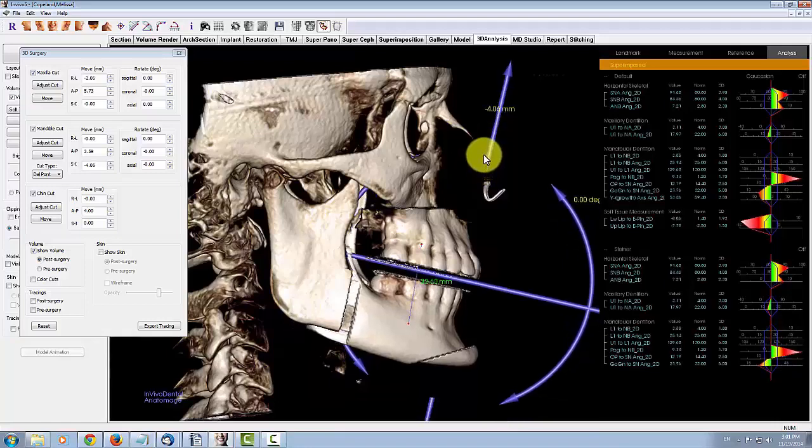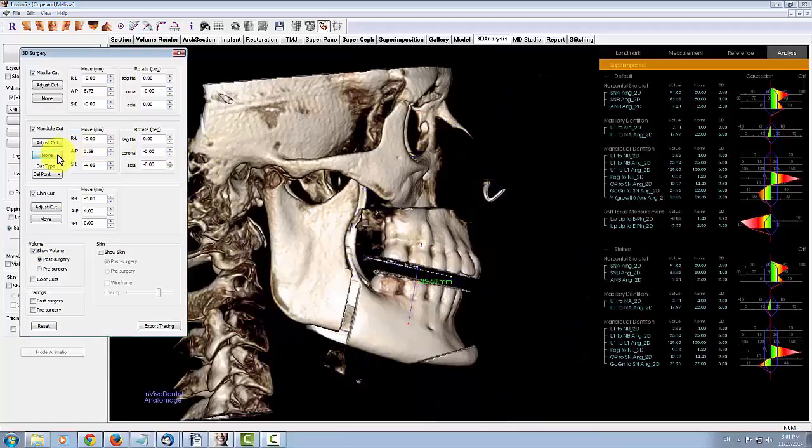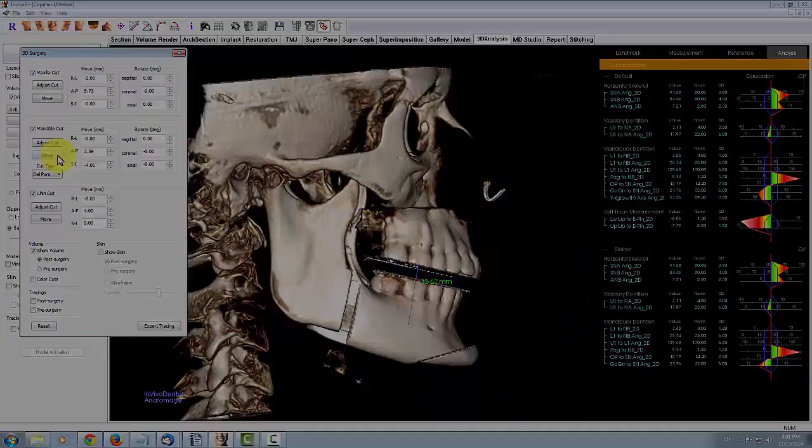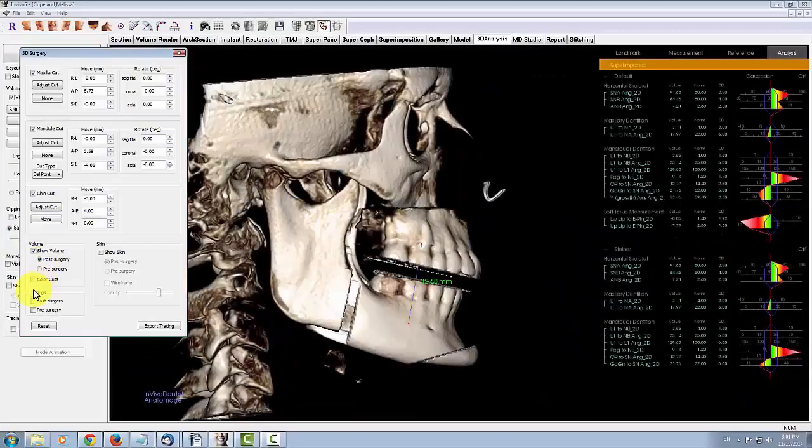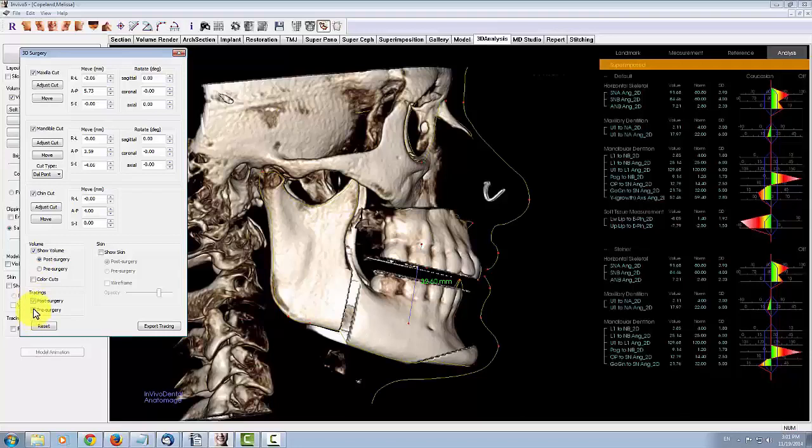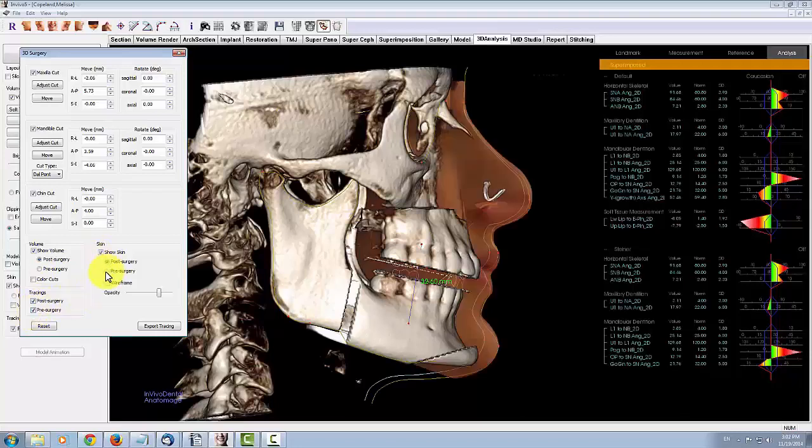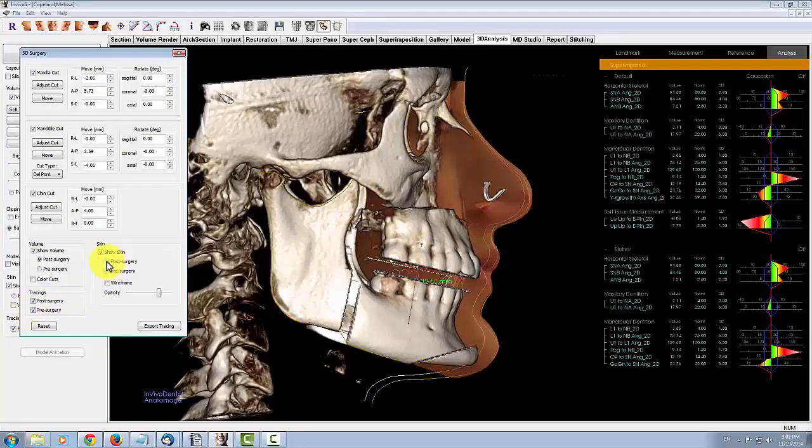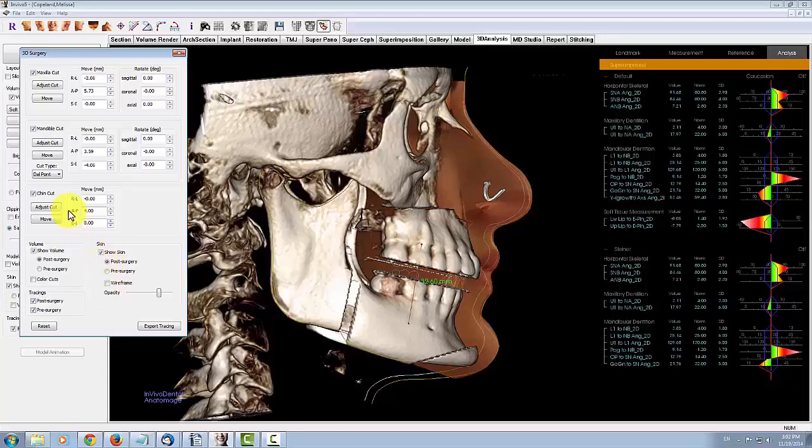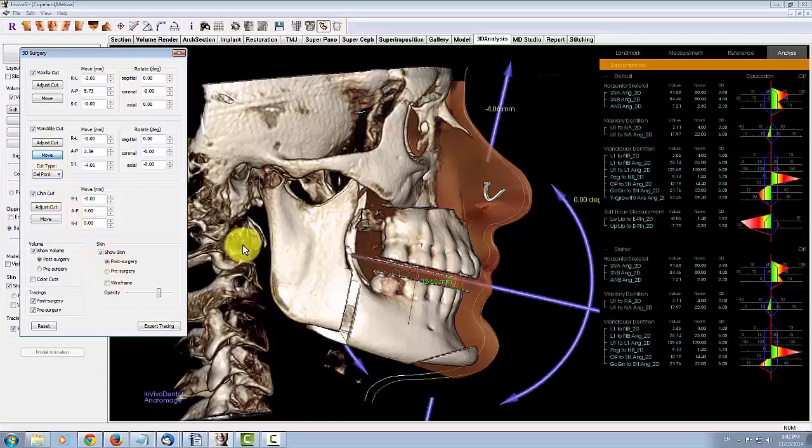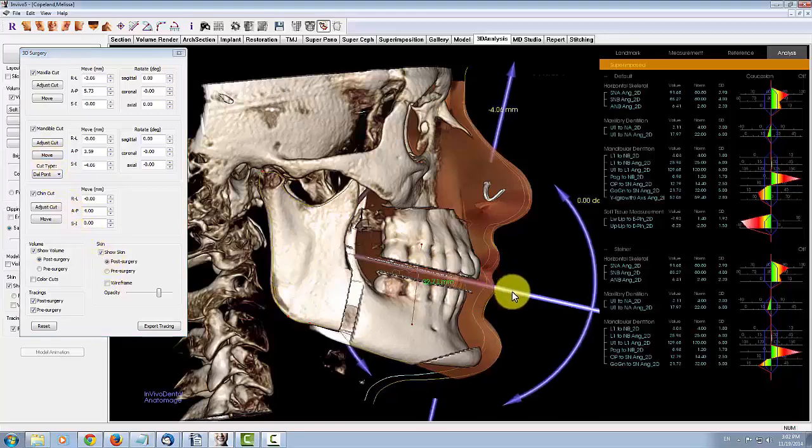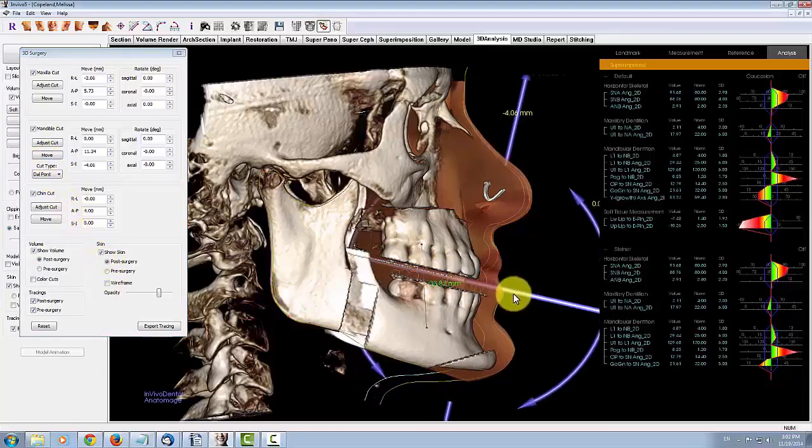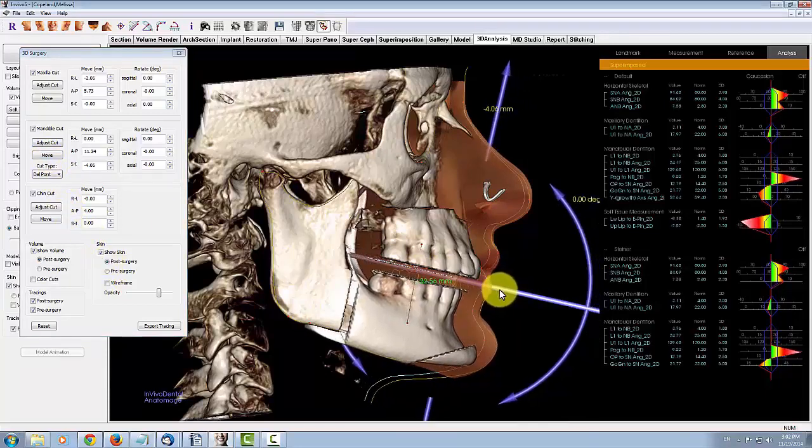If you have a skin overlaid with the scan, you can visualize the soft tissue deformation as you move the cuts by toggling on the skin visibility. Here we have the pre- and post-surgery soft tissue predictions. As we move the volume to simulate surgery, the soft tissue prediction updates.